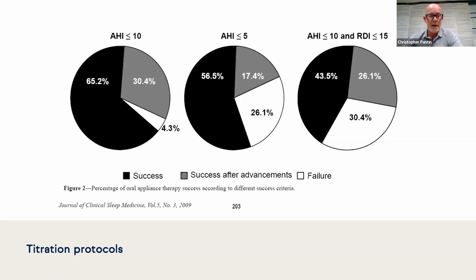So that's a pretty good criteria for adjusting a splint. Again, very cumbersome, not really realistic, especially as it's hard enough to get a treatment sleep study anyway. Most of you would be aware that they can only be offered, legitimately, by a sleep specialist.